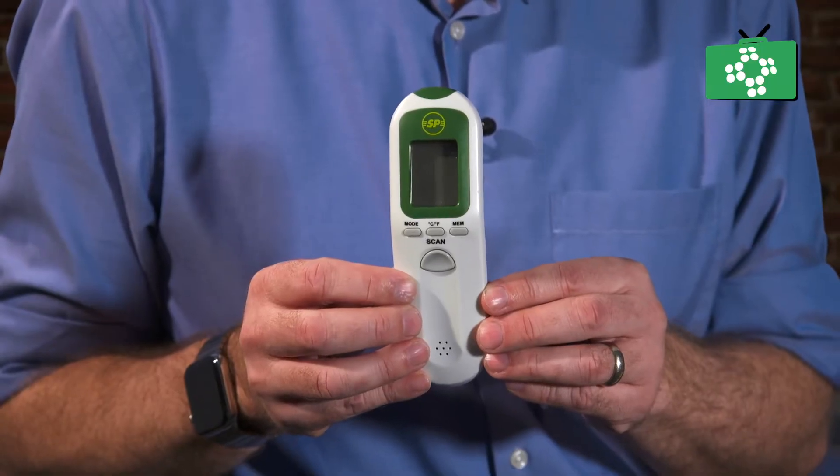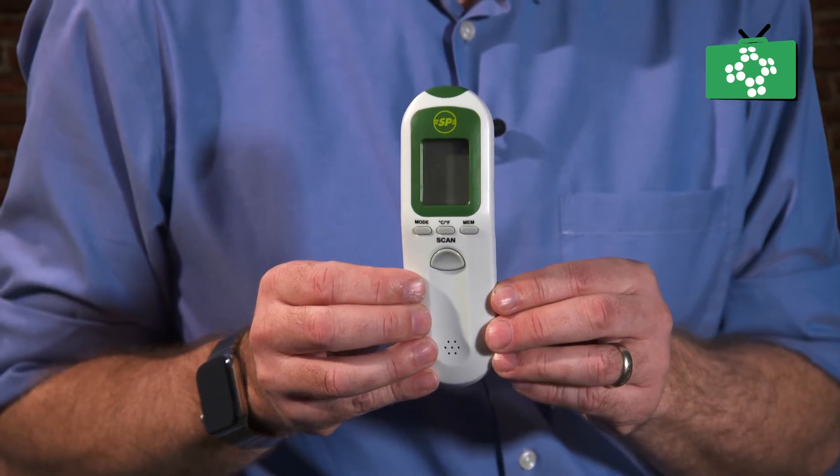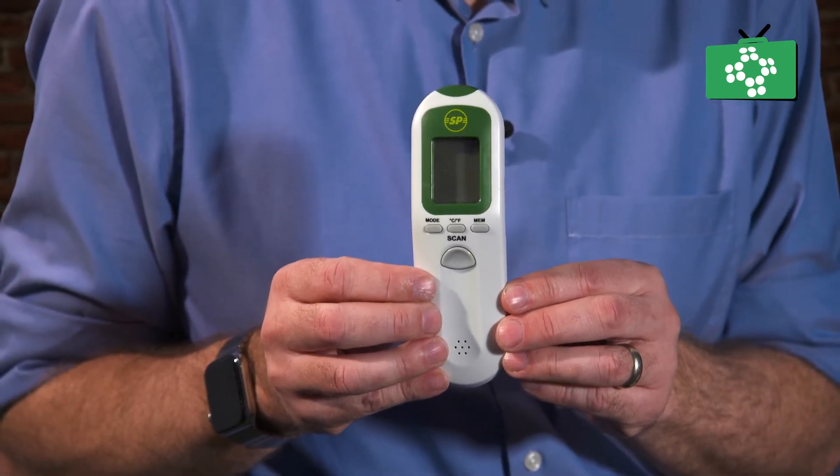With the non-contact thermometer, you have a button on the front, and you can push the button — the display will light up. You hold it away from their skin, usually on the forehead. Hold that for a few seconds and it will give you a clear indication of the temperature.